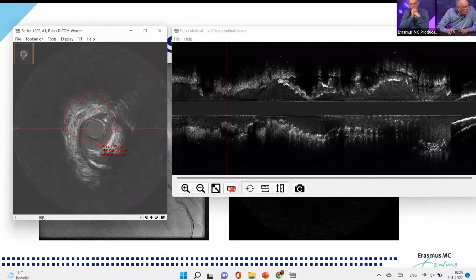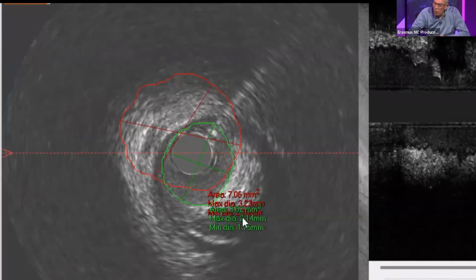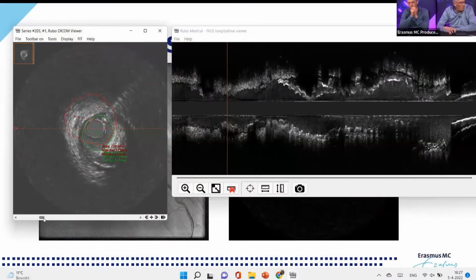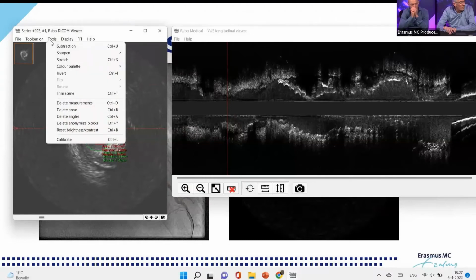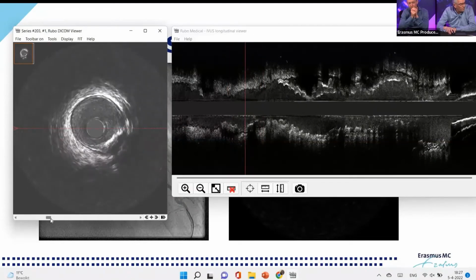Now this is our minimal luminal area. This is more proximal. What we see here is fibrous plaque, fibrofatty plaque, but we also see a small lumen there. And if we measure this here, then we have 3.02 square millimeters. So that tells us two things. One is that the MLA is below 4 square millimeters, which is a very rough binary threshold that you could use. But it's almost below 3. And at that stage, I think there's little discussion as to whether this is relevant. Also, given the fact that this reference area is 7.